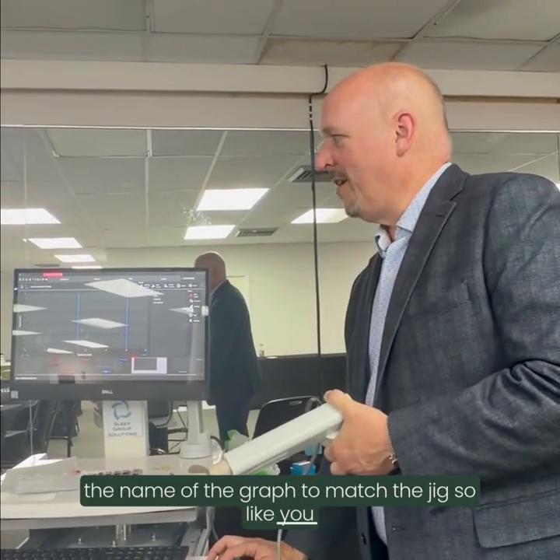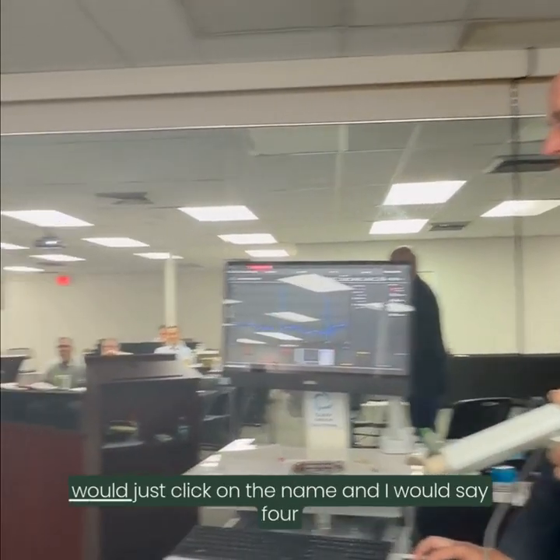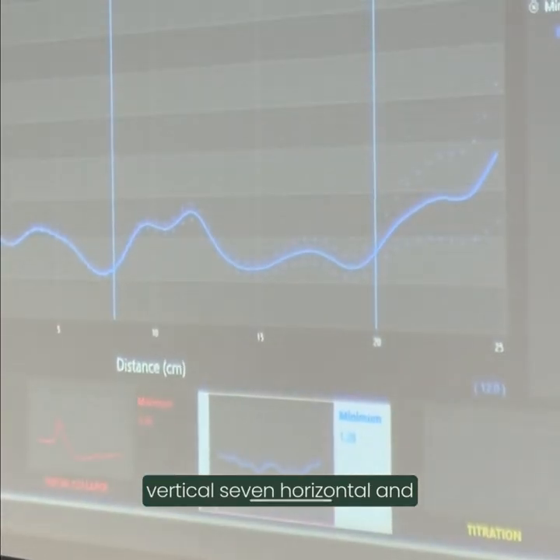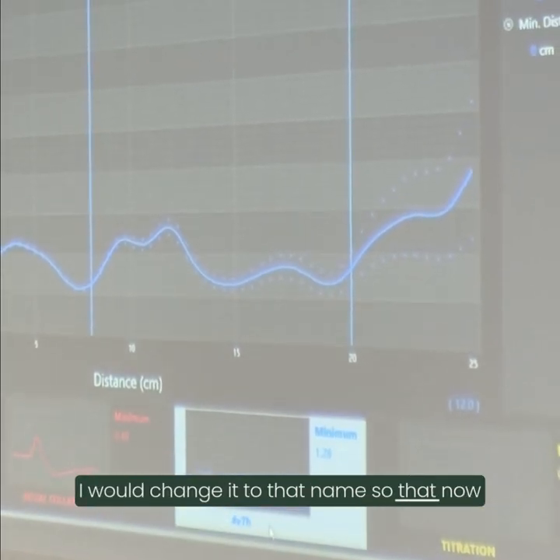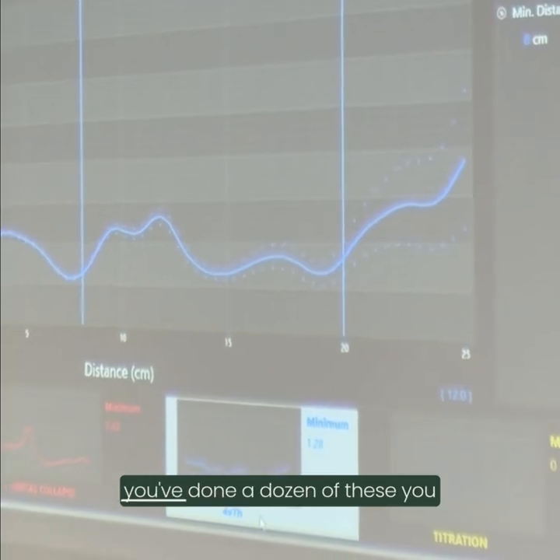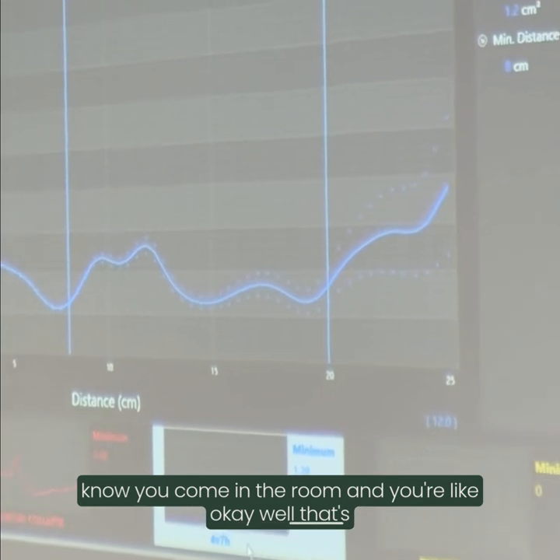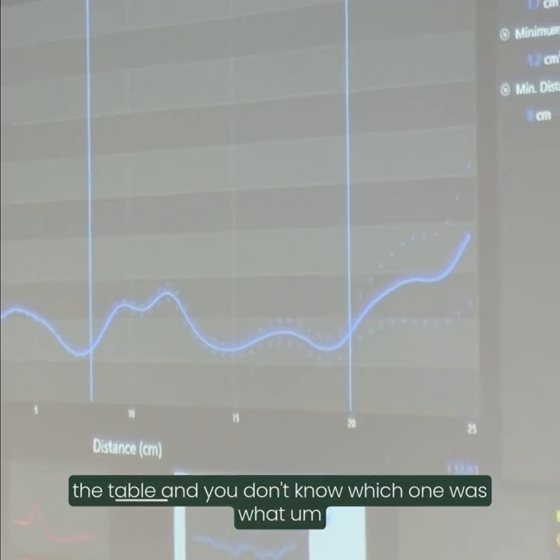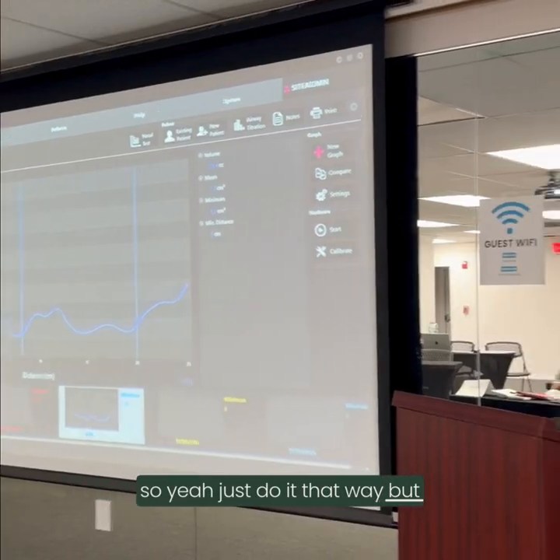So like, this first graph here that says titration, I would just click on the name and say 4 vertical, 7 horizontal, and change it to that name. As you've done a dozen of these, you come in the room and you're like, okay, that's the best one, clearly. What was that? And there are jigs all over the table and you don't know which one was what. So yeah, just do it that way.